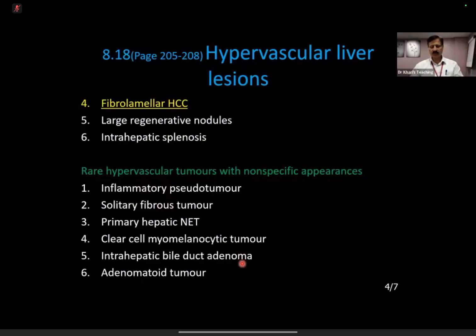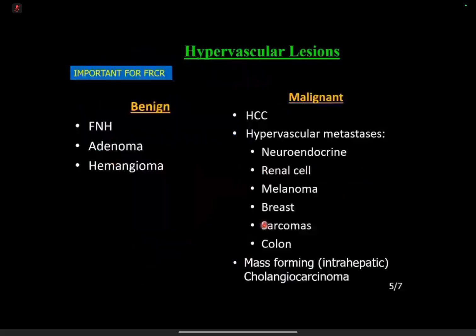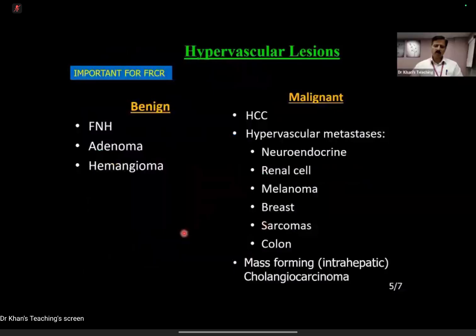So let's go back to a simpler point to remember. And this is the key thing which you have to remember for your exam. It's quite easy actually. And please remember that in your real world also, these principles which I'm going to teach you, they will work in most of the cases. Always keep your minds open. You can be wrong, but generally speaking, these principles, they work very well.